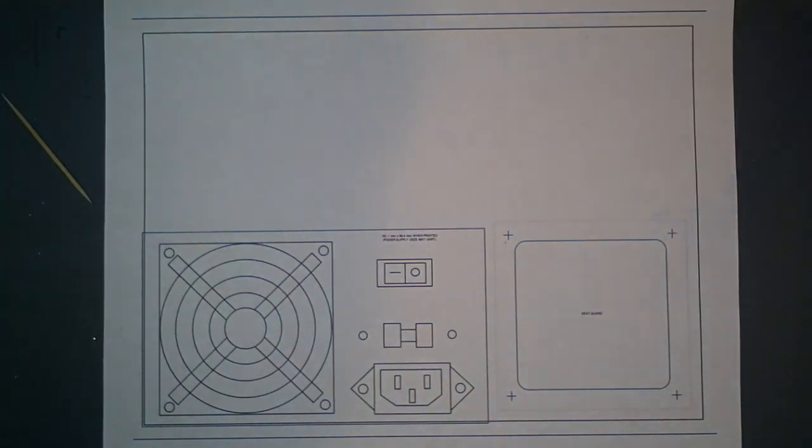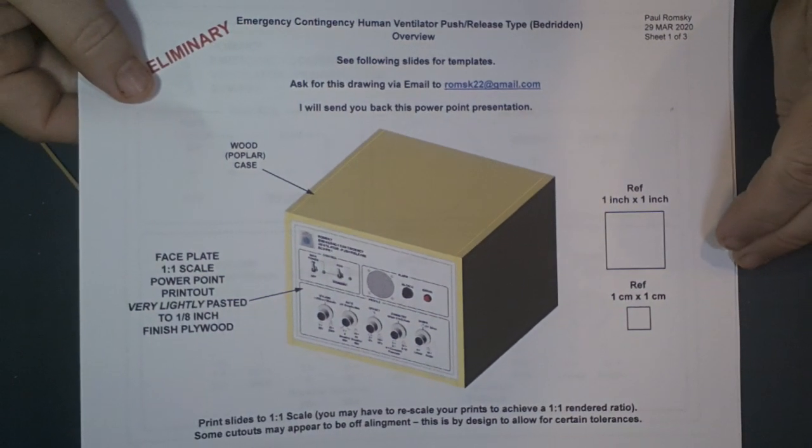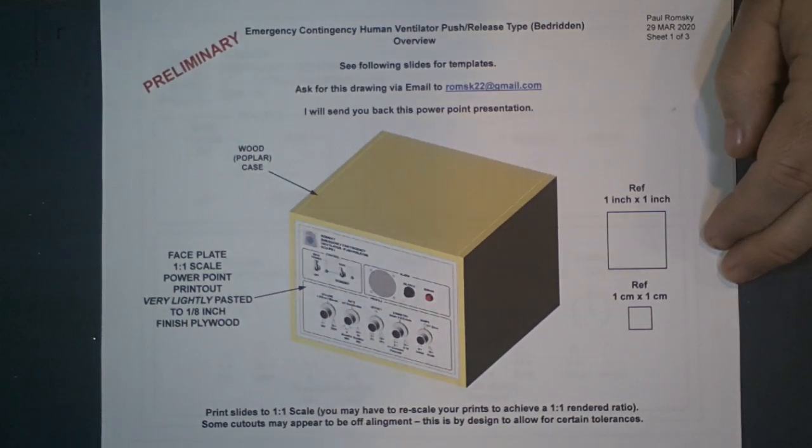So that's a quick little video on how I'm going to do the box to put all the fan and the power supply and everything else in there. And maybe I should make another video later today that shows you how to do all that.